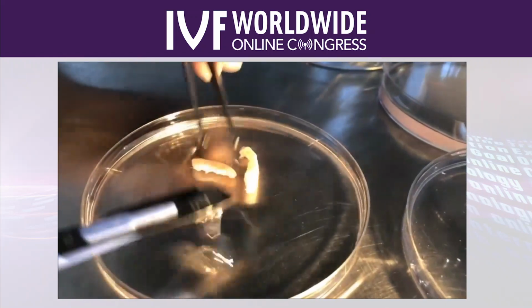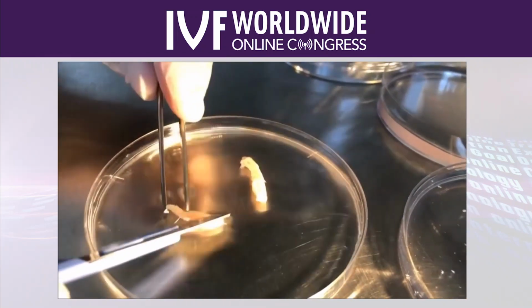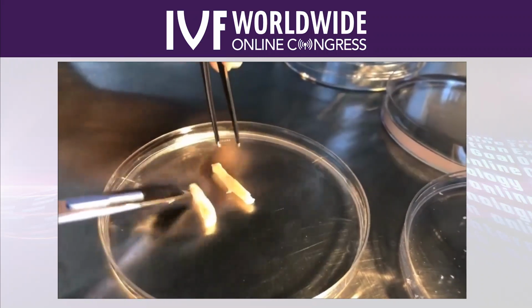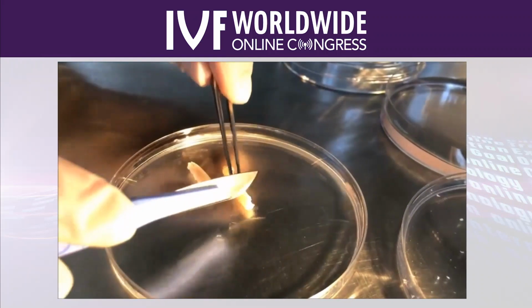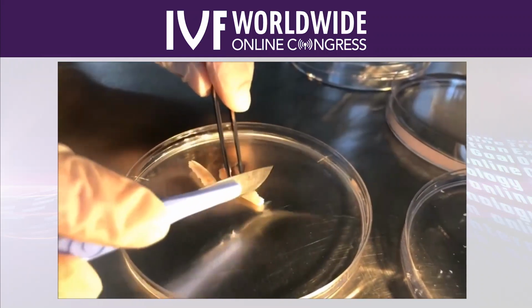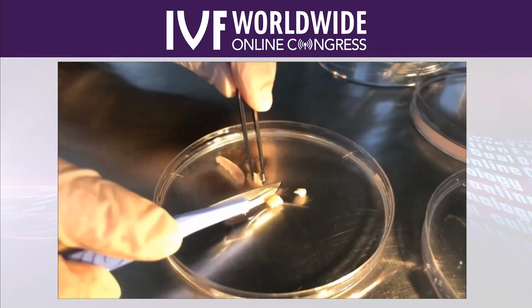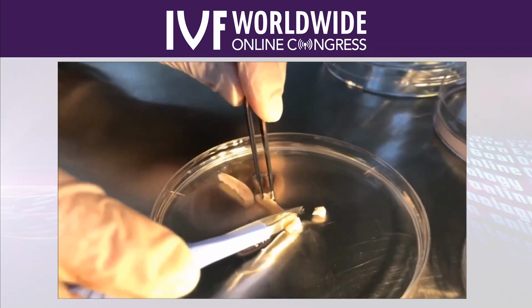So now we are done. You can see here we have the cortex, and then we'll simply cut it into smaller pieces. So these pieces are, of course, a lot smaller than the ones we prepare for the adult ovaries, but again, these pieces are just packed with follicles.